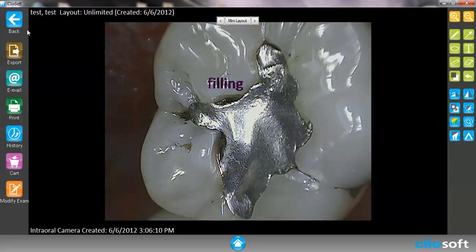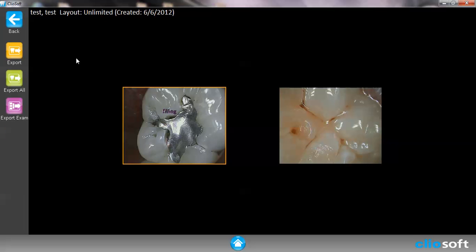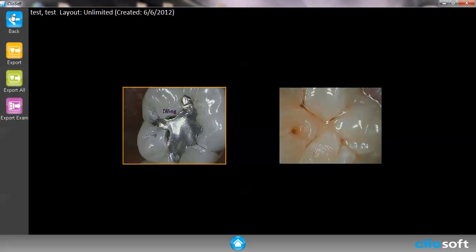On the left side of the menu we have exporting, emailing, printing, and cart features. These are all simple tools that we want to implement and make very easy. So if I want to export this image I can simply hit Export, choose the image that I want to export, and then it'll tell me where I would like to export the image to. We'll go into more detail on that in a different video.